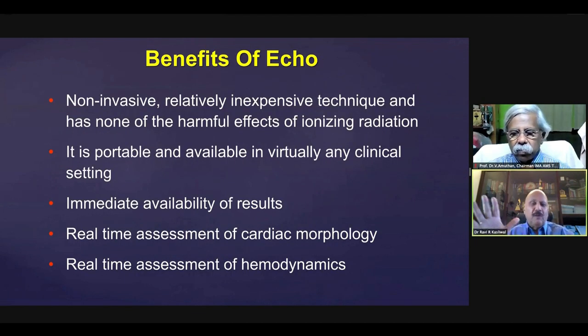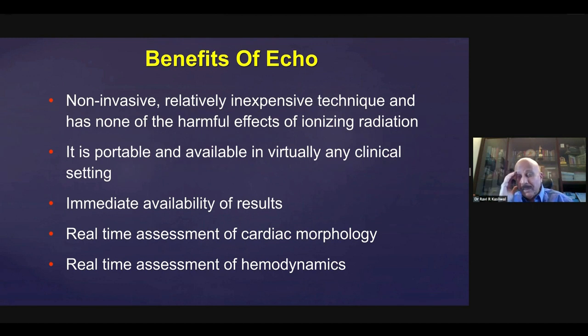What are the benefits of echocardiography? When I was a senior resident at the All India Institute of Medical Sciences, when the first echo machine came there, one of the things that we realized immediately was the portability of the equipment, available in virtually any clinical setting, immediate availability of results, and the fact that it was a non-invasive, relatively inexpensive technique, and has none of the harmful effects of ionizing radiation. So these are some of the strengths of echocardiography.